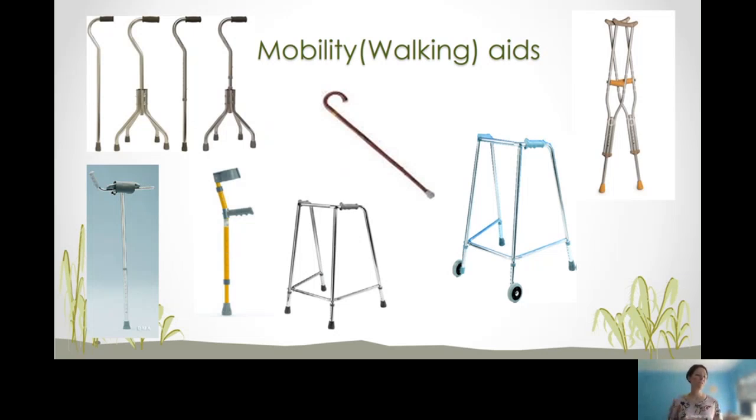Now we move to the left bottom corner. And this, do you remember I told you when there's complications, when there's a fracture of the upper limb, a gutter crutch is often used. So take a look at the hand piece where it sits almost in an upright position compared to a crutch where it's more horizontal. It is because you will put your hand and forearm in and grab onto that gutter crutch. To the right, one of the most well-known mobility aids is the humble crutch.